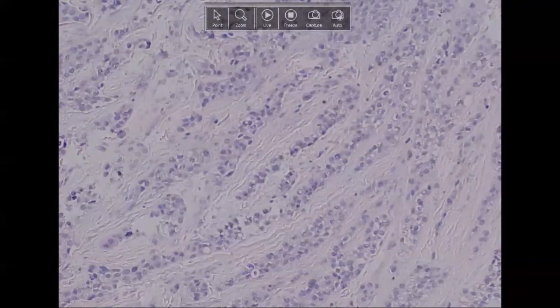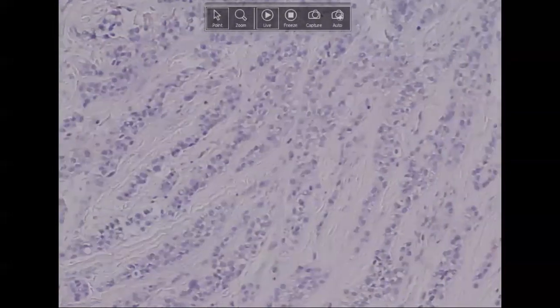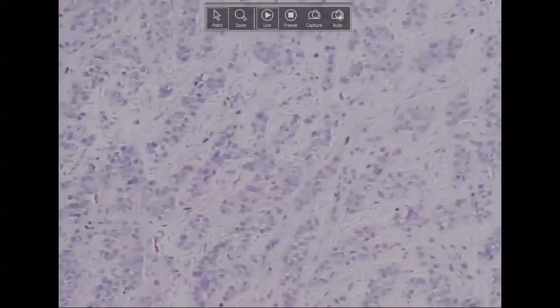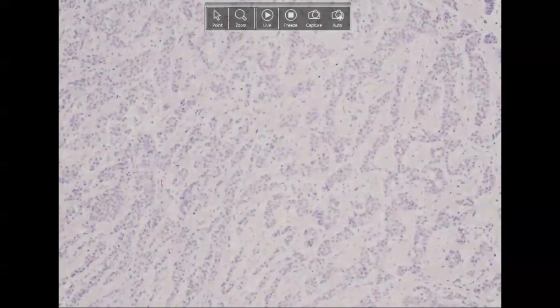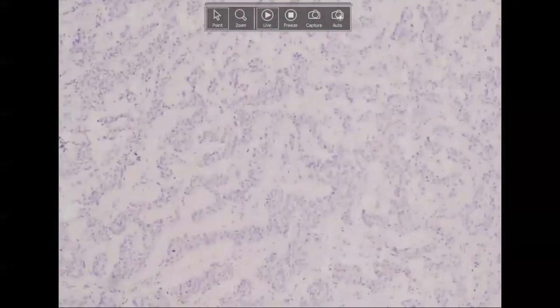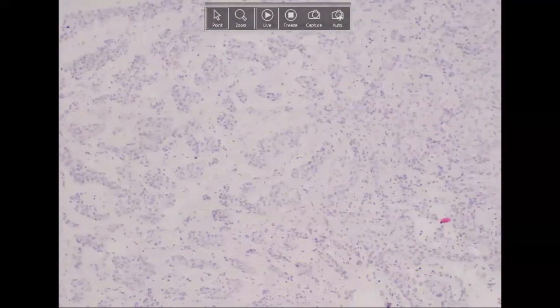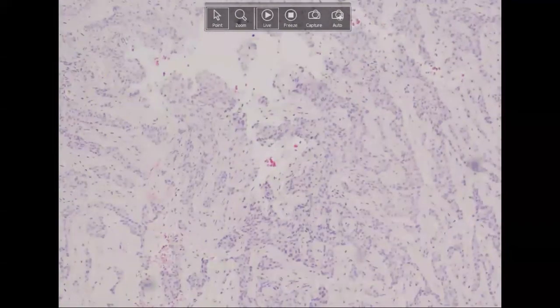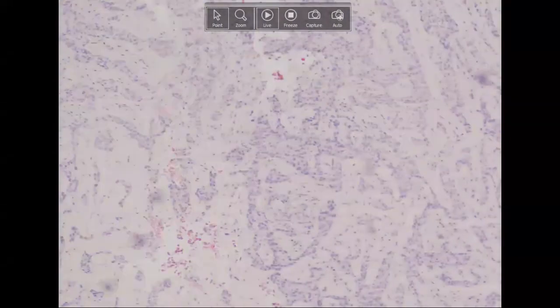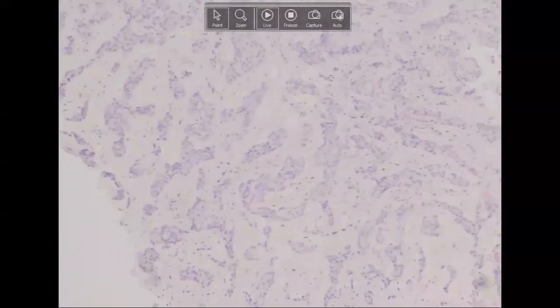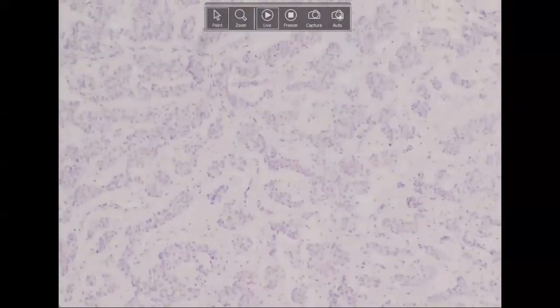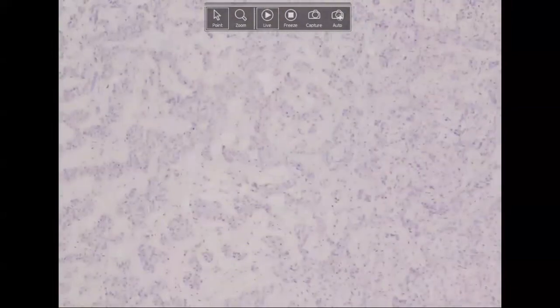The EWSR1 gene has been described in the translocation for this entity — in fact, this lesion was EWSR1-positive on FISH, making it a relatively sensitive and specific test for this entity. The controversy is whether this is the same entity as the hyalinizing clear cell carcinoma of salivary glands, since we can get salivary metaplasia within the jaws. Usually if it's confined or centered within the bone, we'll call it clear cell odontogenic carcinoma, versus if centered in the soft tissues, we may think about salivary origin — both can have the same translocation.